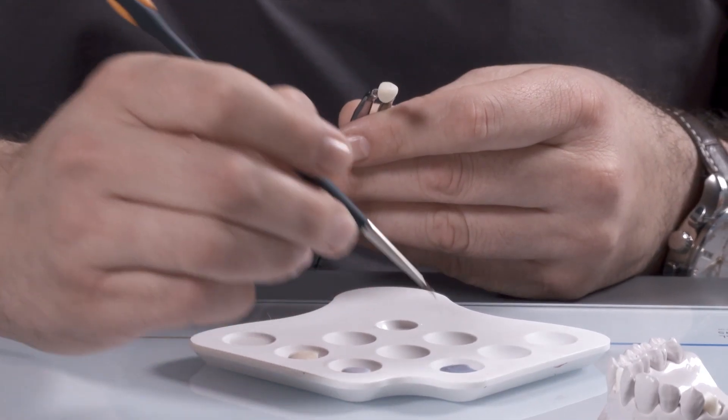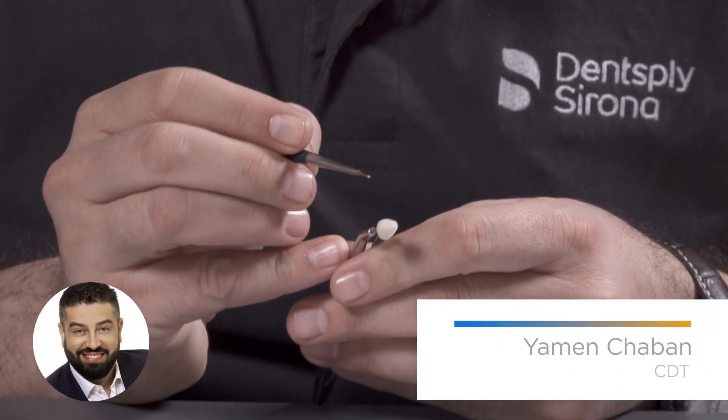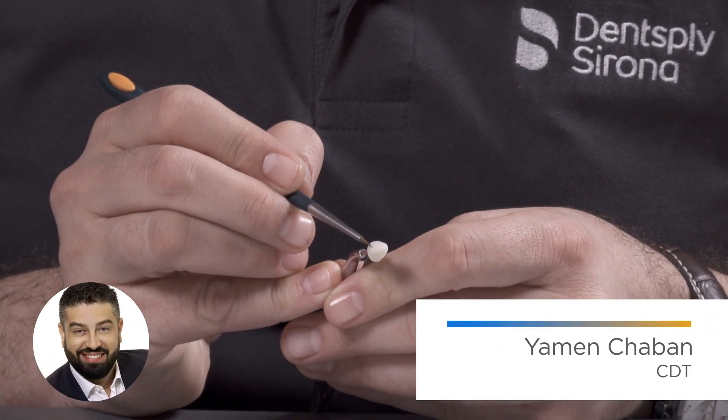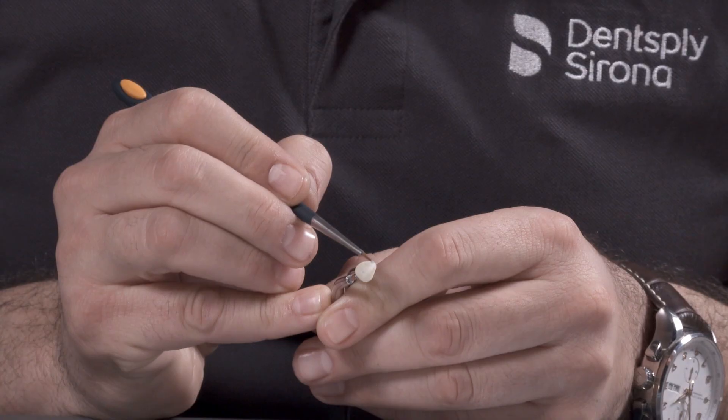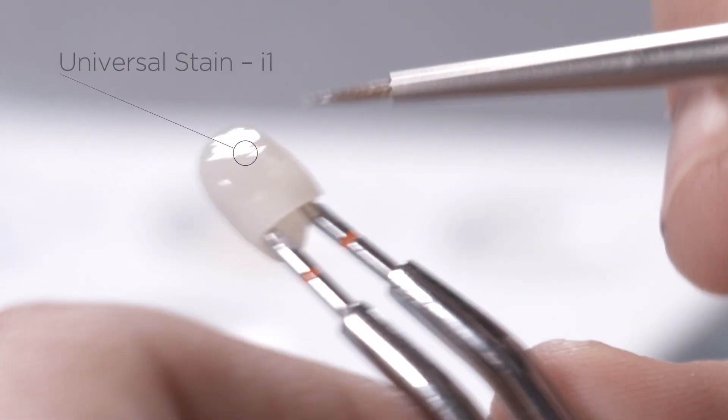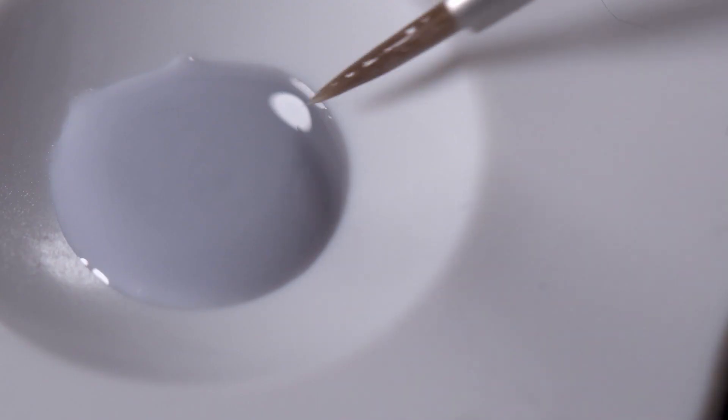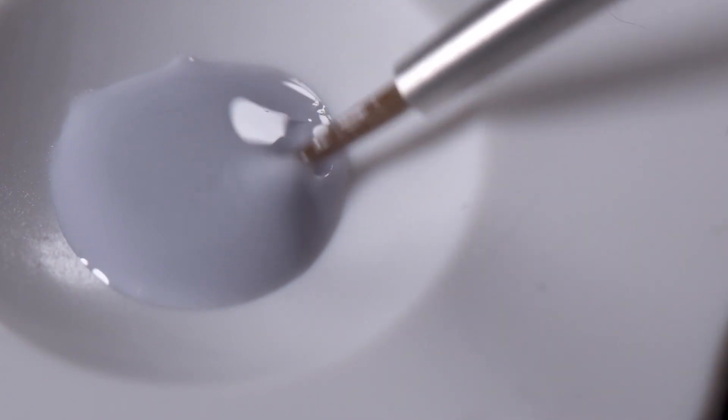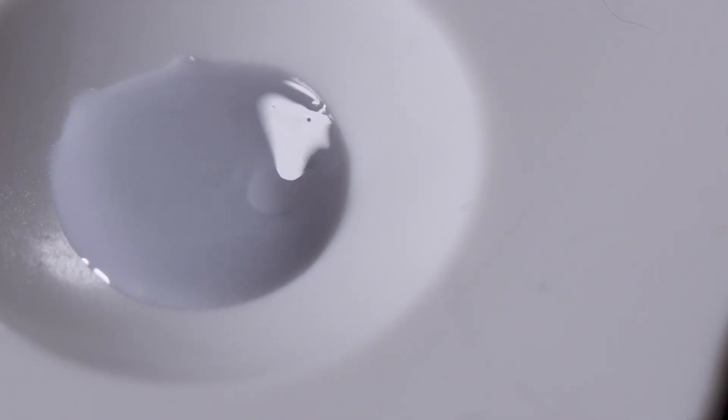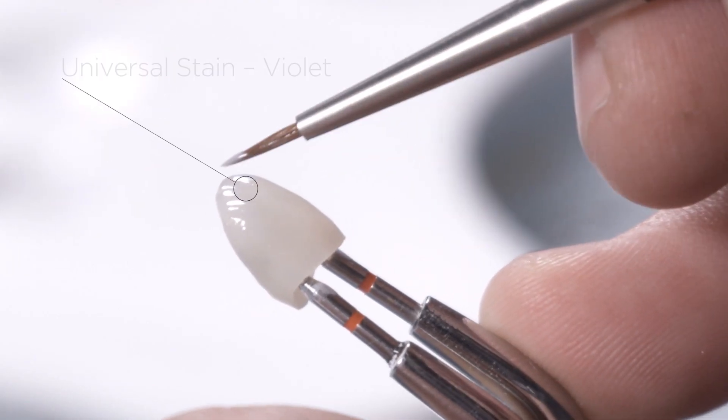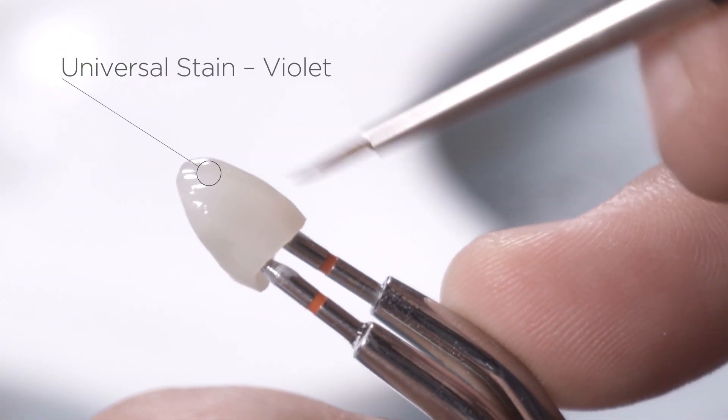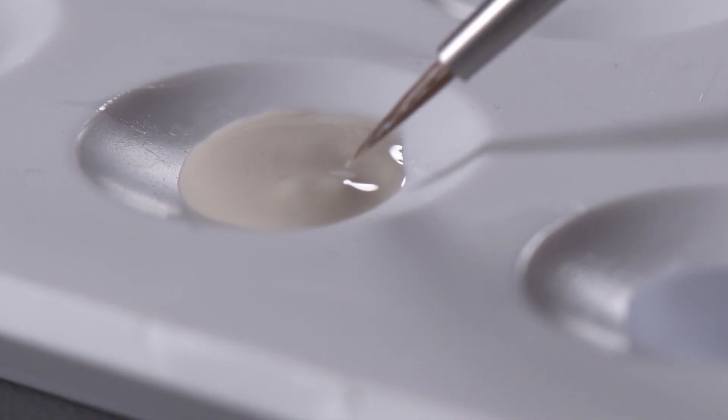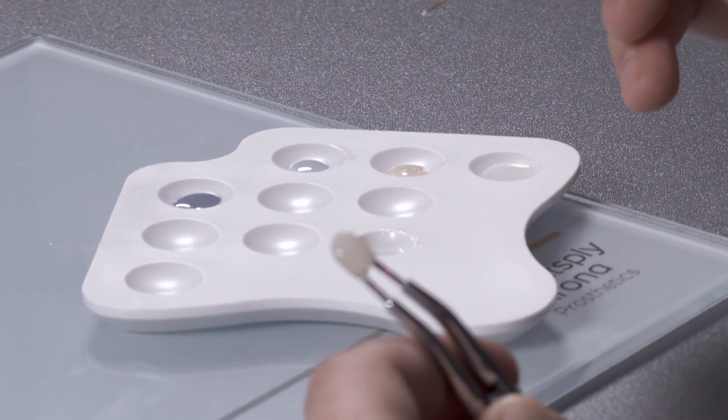Customize the mesial and distal ridge areas with incisal stain I1. Then highlight the areas between the Mamelons with some violet, and characterize the Mamelon structures in the incisal area with cream stain.